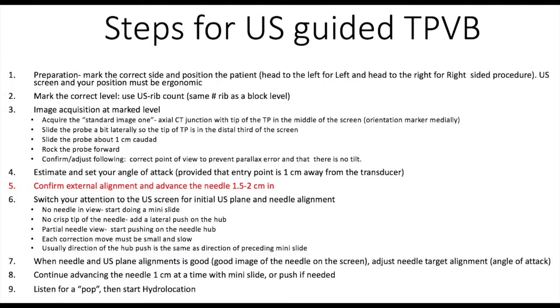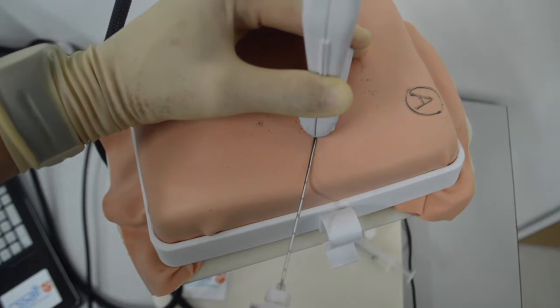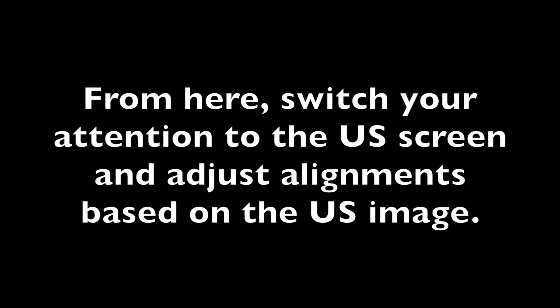Confirm external alignment and advance the needle 1.5 to 2 centimeters in. Next, advance the needle under the ultrasound probe up to the 2 centimeter needle mark at the skin. Be sure to have the needle hub and tip aligned with the long axis of the transducer. From here, switch your attention to the ultrasound screen and adjust alignments based on the ultrasound image.